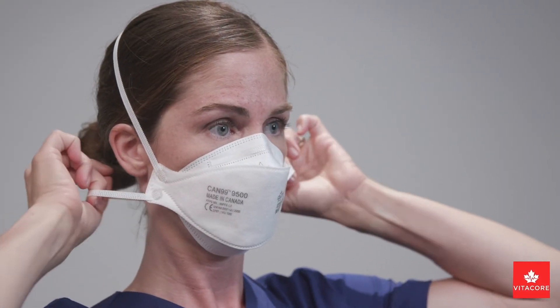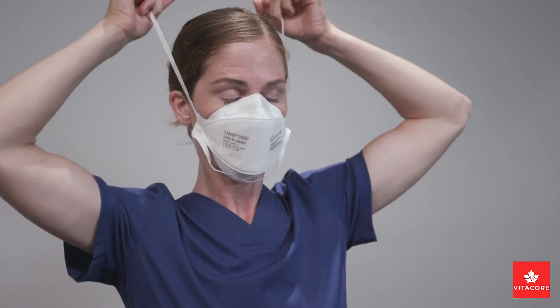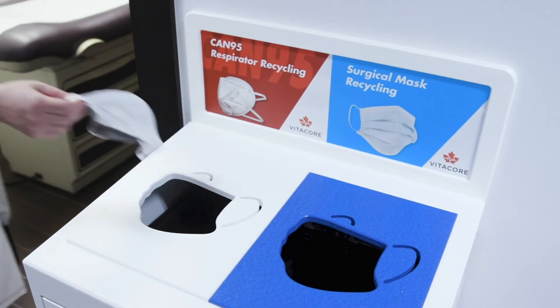When doffing your respirator, do not touch the face piece. Gently lift the bottom strap around your neck over your head, followed by the top strap. Remember to never touch the face piece. Carefully remove the respirator without it coming close to your body.